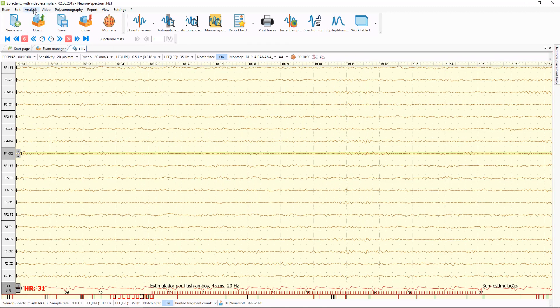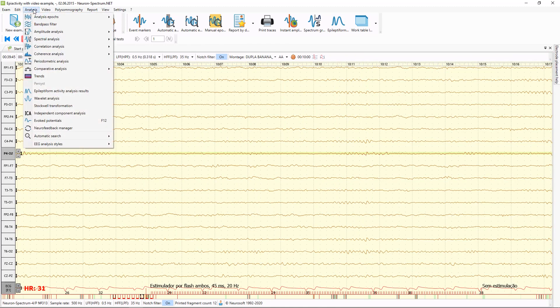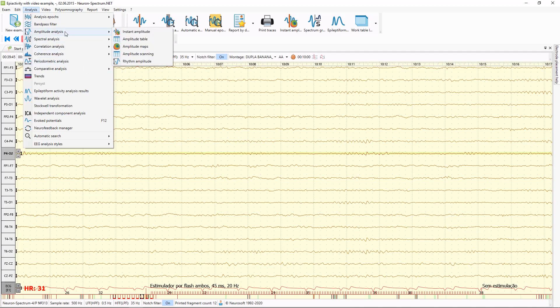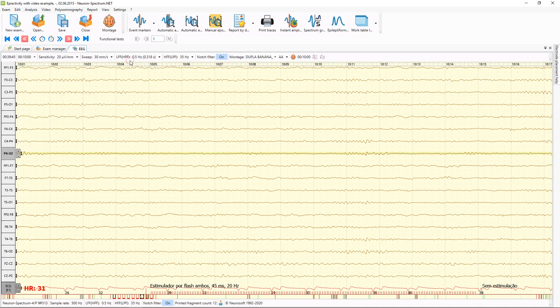Also, using the Analysis main menu, you can open different windows with different types of analysis — for example spectral analysis, correlation and coherence analysis, periodometrical analysis, and amplitude analysis.